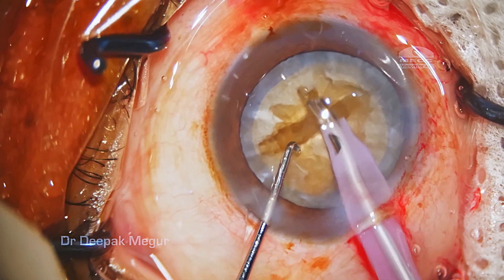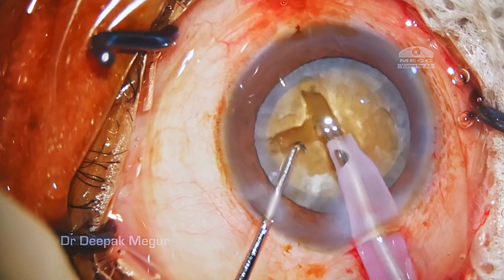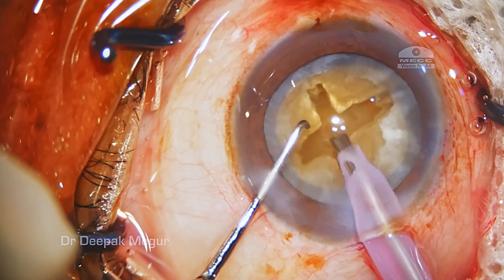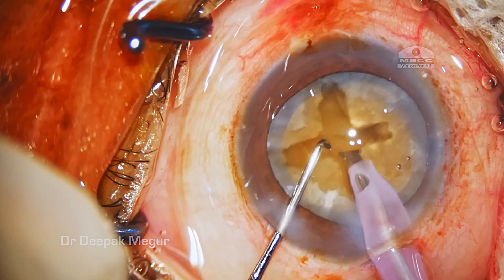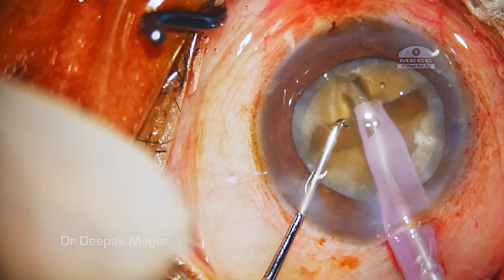The surgeon first finishes the first trench, rotates 90 degrees, and then begins the second trench. Eventually he has created the classical plus sign, which is what is identified with the divide and conquer four quadrant technique. Now let us rewind and try to analyze the possible errors in this technique.